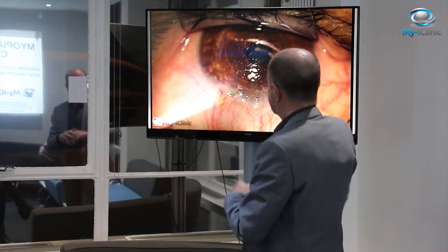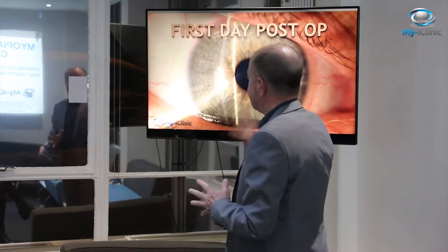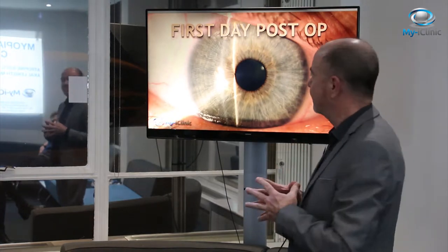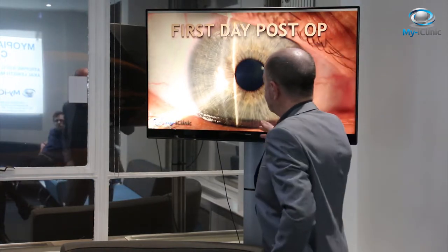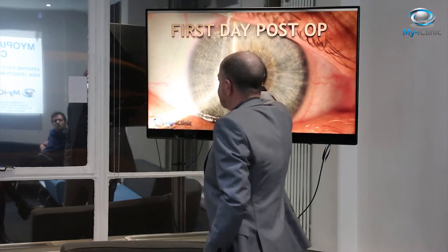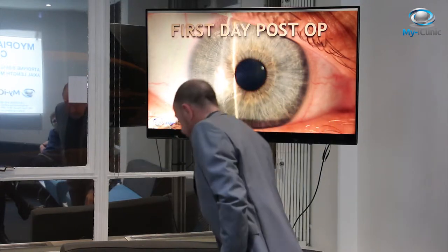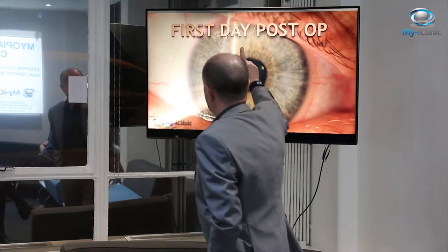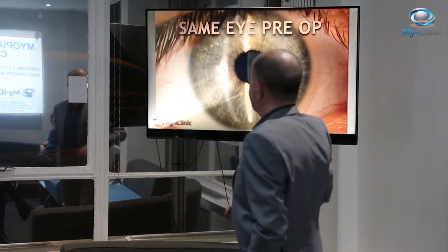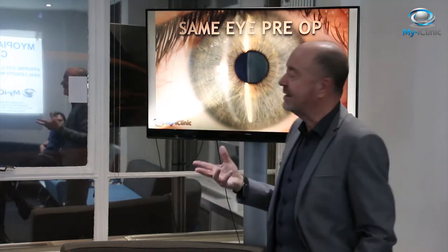Here is a patient less than 24 hours post-op. Plano — minus 0.1 vision. When you look very carefully, you can see something at this stage, but basically you can see nothing. And the patient sees everything. This is her post-op; this is the same patient pre-op. There really is nothing to see, no difference. It really is as atraumatic as that.